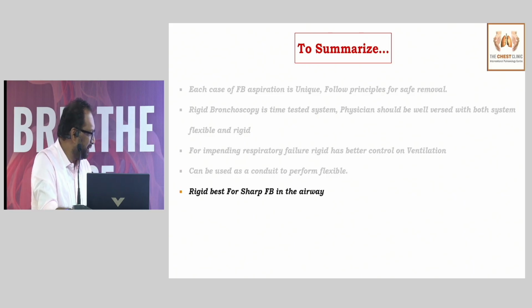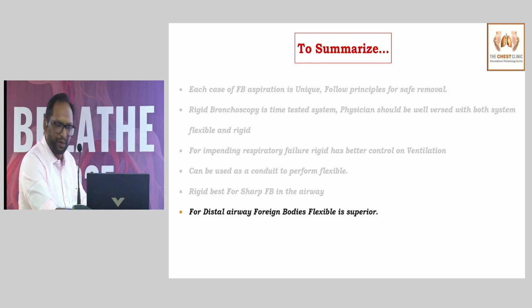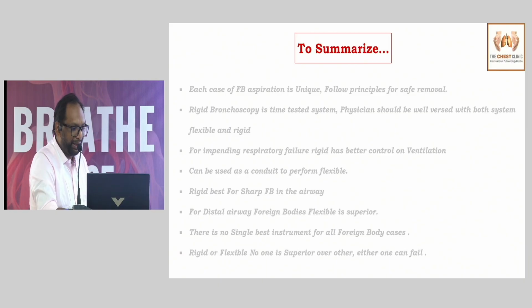For airway foreign bodies that are sharp, rigid is the best system. And for distal airway foreign bodies, flexible is superior over rigid. I feel there is no single best instrument for all foreign body cases. Rigid or flexible, none is superior over the other. Either one can fail. Both are complementary to each other.